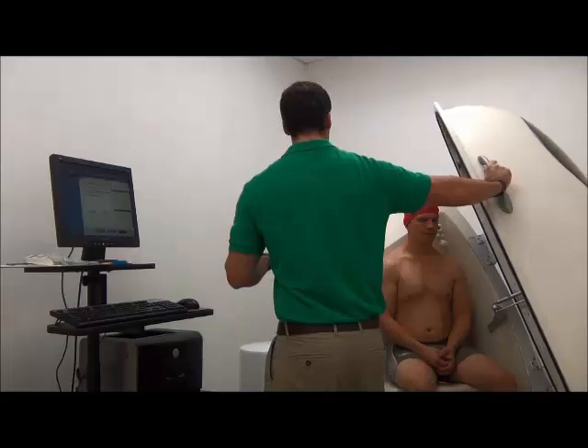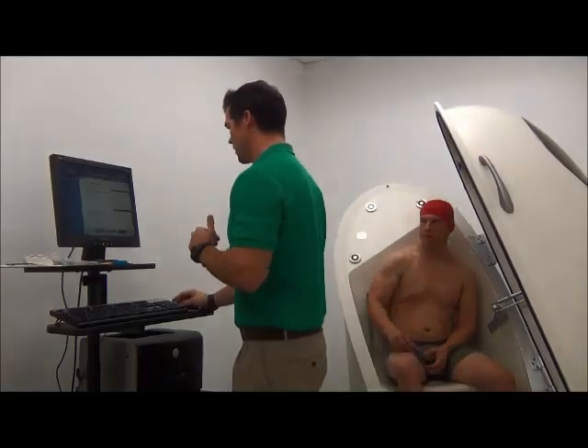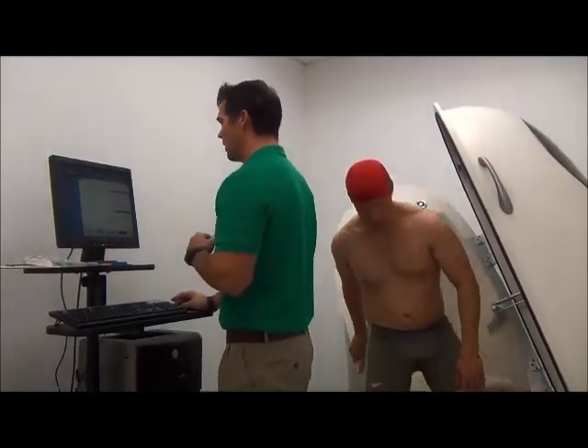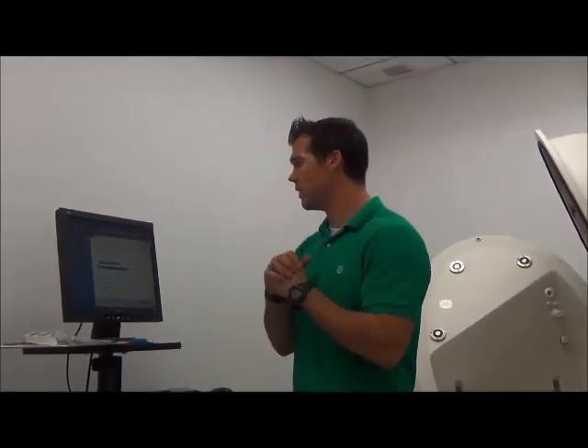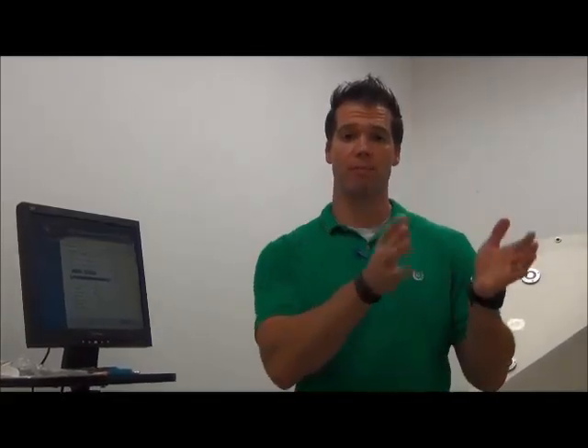That was the bod pod measurement — Curtis can get out. Now it gives a readout of percent body fat. For Curtis, he was about 19% body fat. It also does the math to tell you how much of his body weight is lean tissue — muscle and bone — and how much is fat mass. It will also give an estimate of resting energy expenditure, which is not as accurate as directly measuring it, but it's a rough estimate. That's the bod pod assessment.